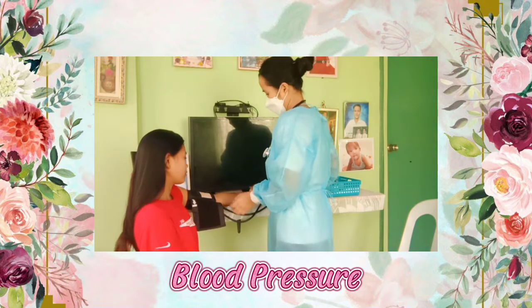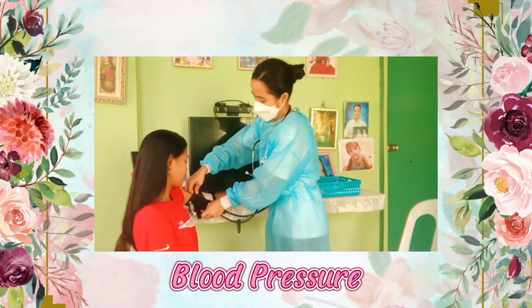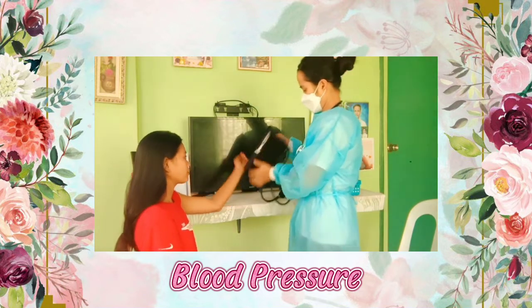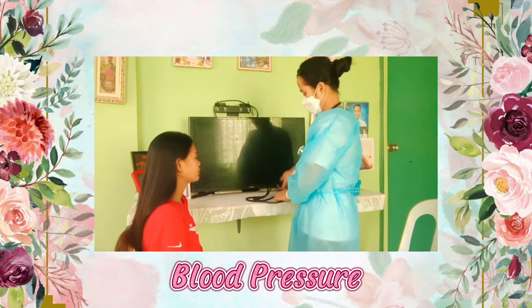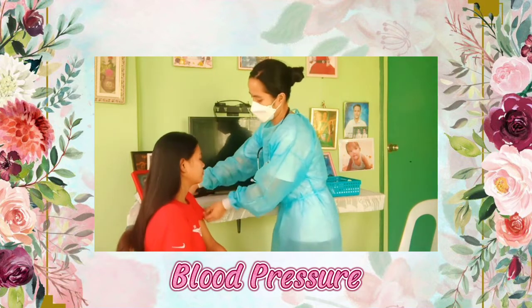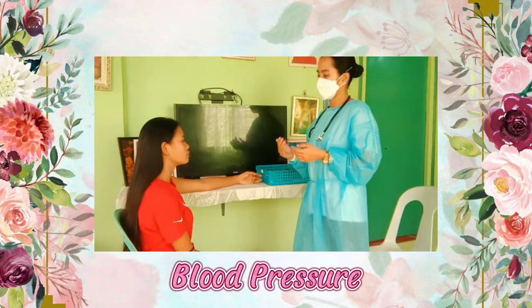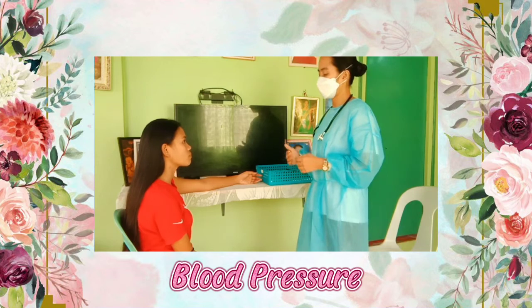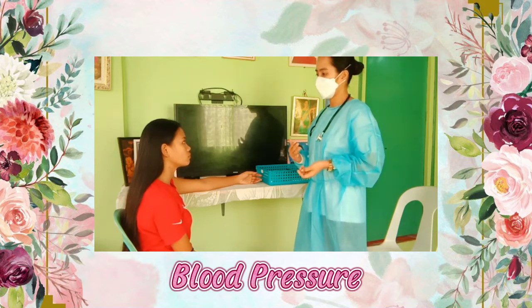Remove the cuff from the patient and help her return to a comfortable position. So your blood pressure, ma'am, is 106/85, which is actually normal for 18 years old and above.